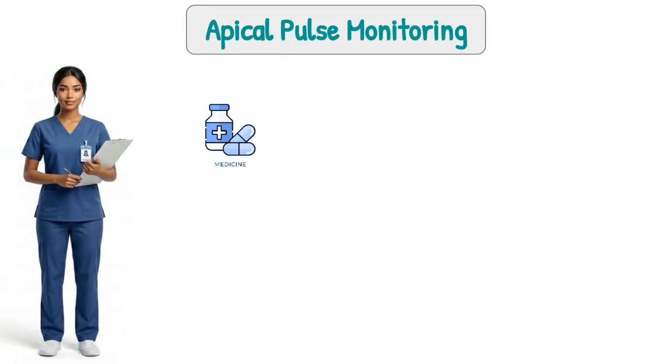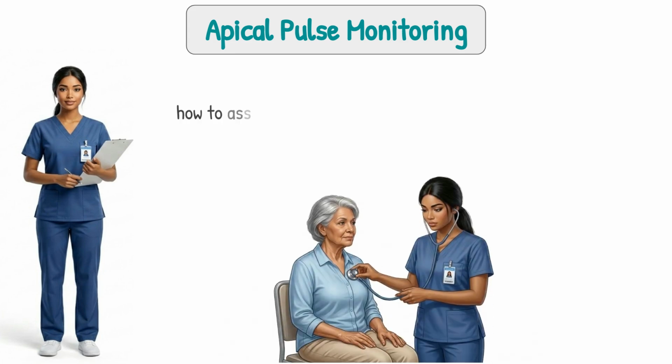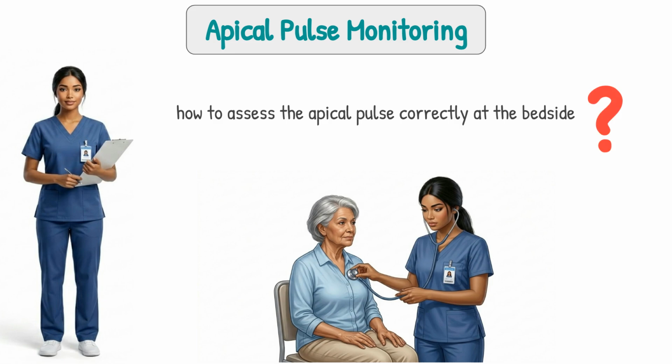Before giving certain medications, a nurse must know one important skill that can prevent serious complications. That skill is apical pulse monitoring. Today, let's learn how to assess the apical pulse correctly at the bedside.